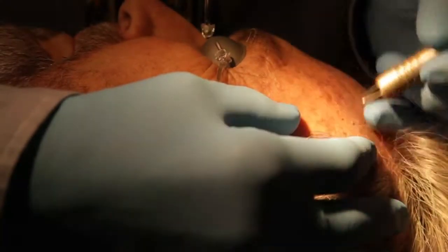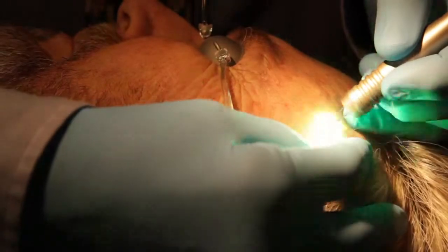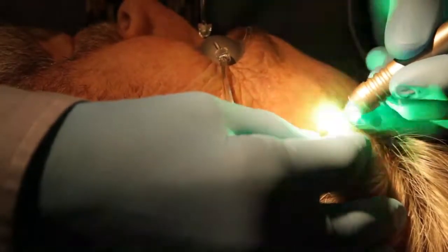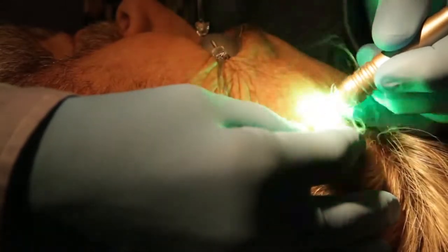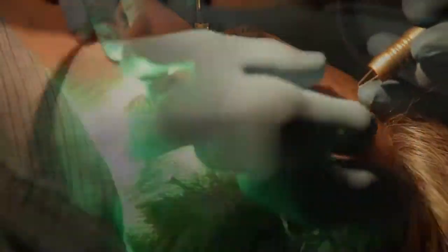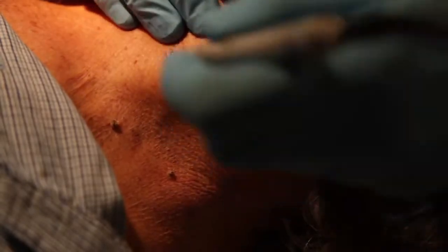The laser produces two wavelengths of light, a green and a yellow. The green is excellent for getting rid of pigmented lesions such as freckles or lentigos, pigmented moles, pigmented seborrheic keratoses, pigmented solar keratoses and pigmented skin tags.